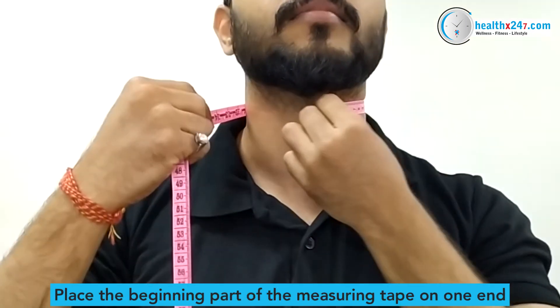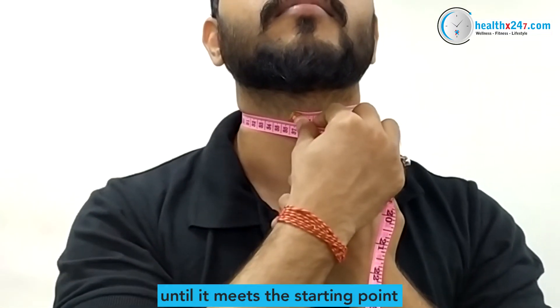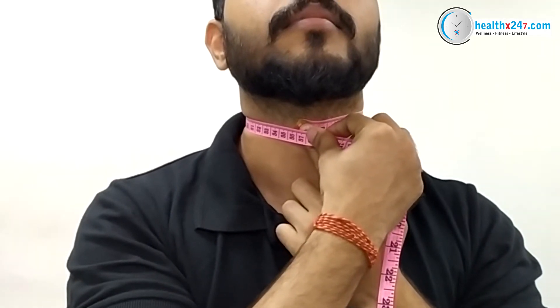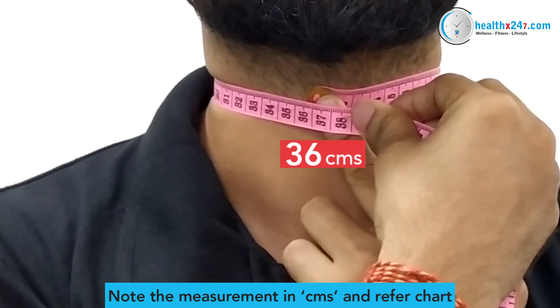Place the beginning part of the measuring tape on one end. Wrap the measuring tape around your neck until it meets the starting point. Ensure the tape is straight and snug. Note the measurement in centimeters and refer to the sizing chart to know the best size for you.